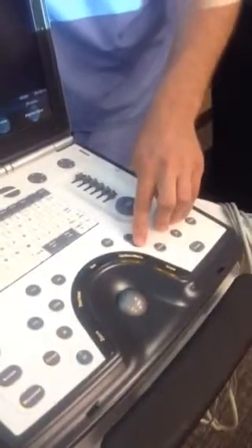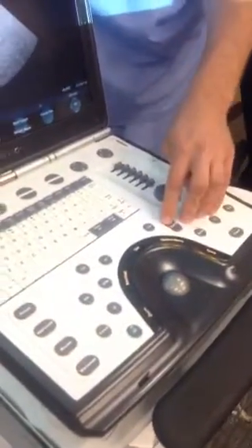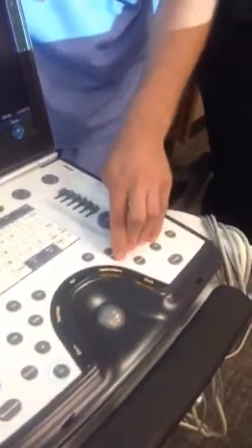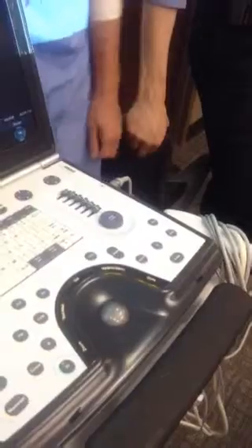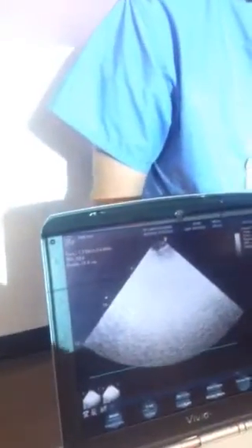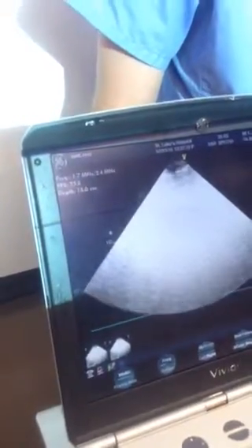And that's going to allow you to, here I have to unfreeze it, that's going to allow you to either toggle in or toggle out, more or less depth. See those buttons on the left there, the little hash marks with the yellow? Just look at that if you don't know which way you're going. This is centimeters? You see more numbers. Yeah, 5, 10. Sorry.